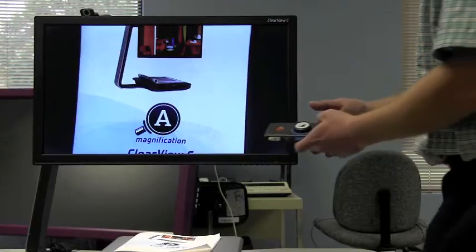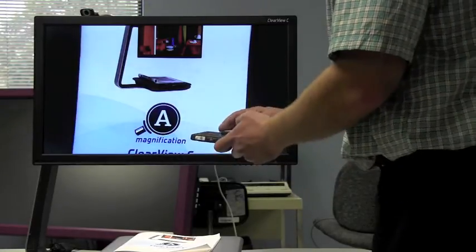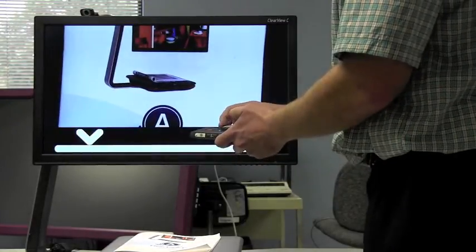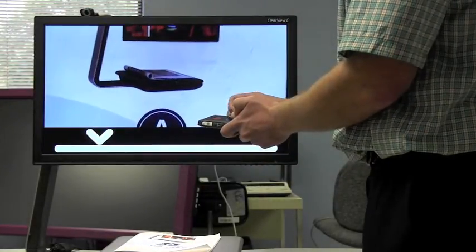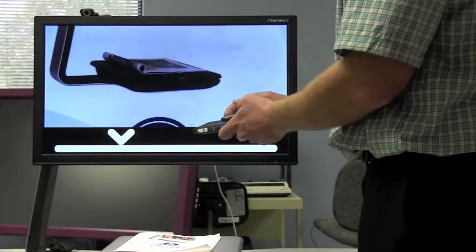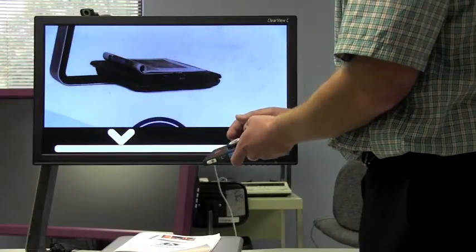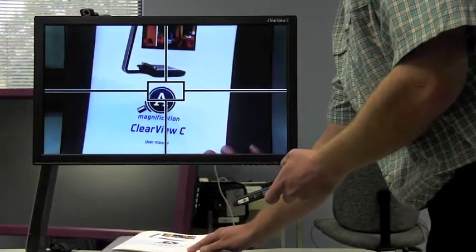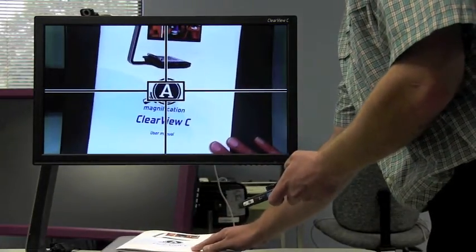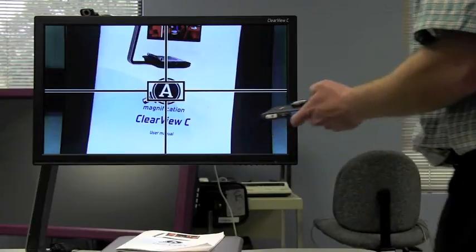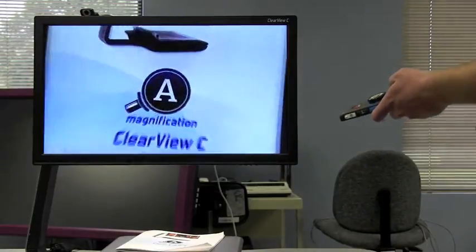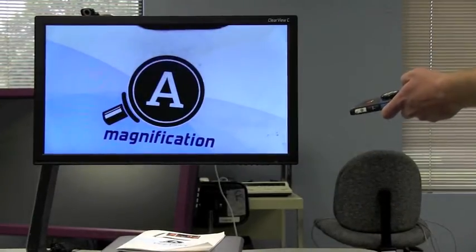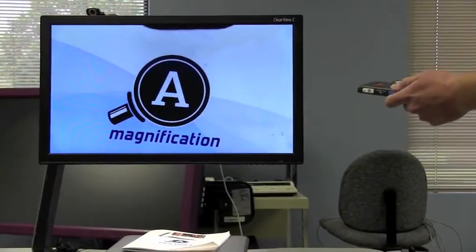You also have a find feature here. If you're zoomed in on something, you can touch your find feature and it'll zoom out. Let's say you want to zoom right in on this A. Zoom right in on that A.